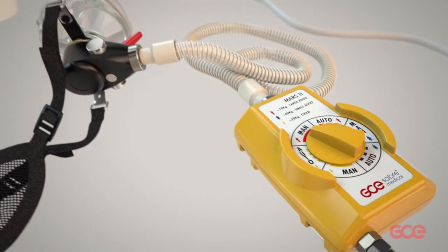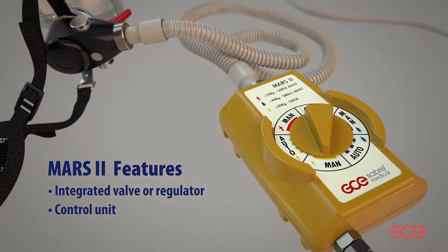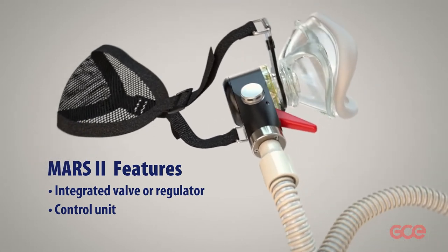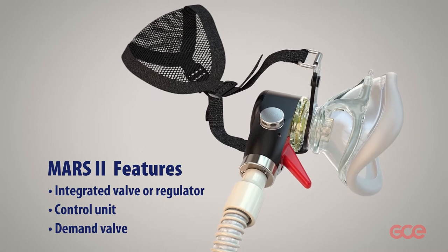Turn the switch to select the correct setting for either large adult, small adult, or child. The control unit is fluorescent to allow for good visibility in the dark. The demand valve also has a manual trigger, which can be used when administering CPR.